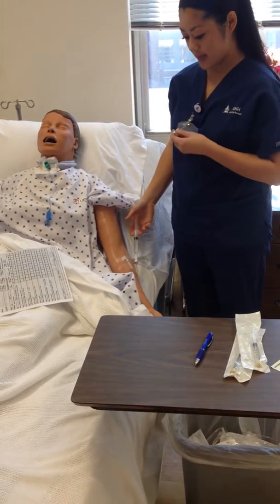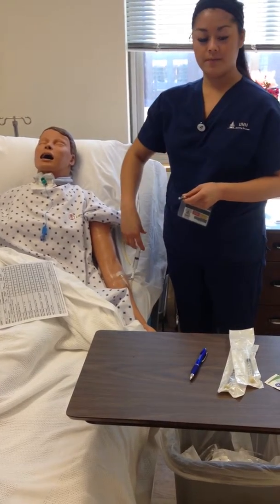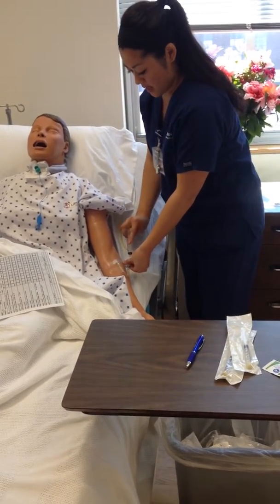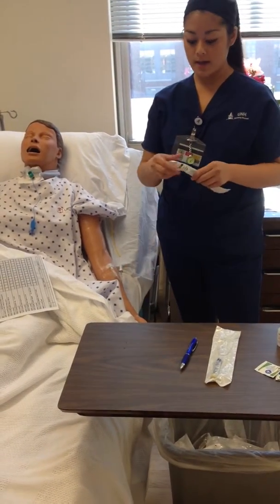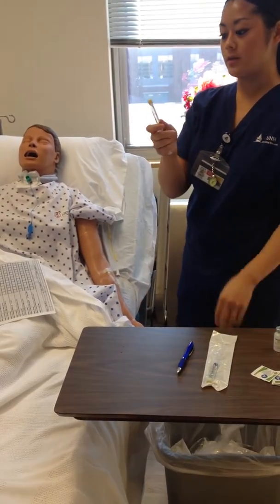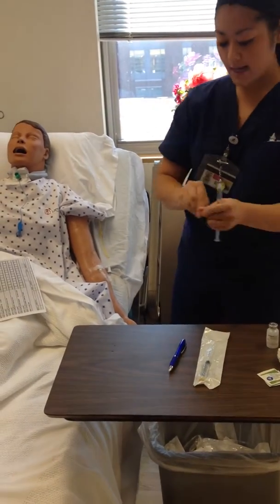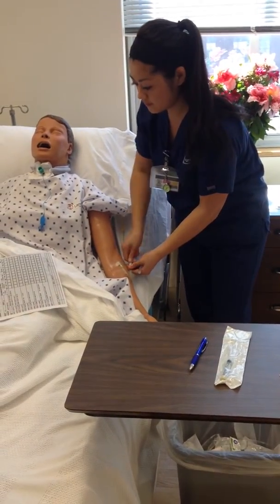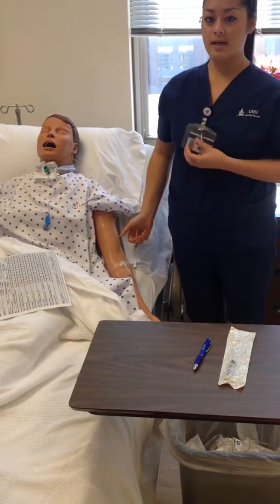So we take our watches and administer this over 2 to 3 minutes, pushing it slowly. So we're going to do a time lapse, and that was over 2 to 3 minutes. Next, we need to flush the line again because there's some medication in the line. And because that's the same medication, we need to do the same rate of administration. So this is going to go into the patient at 2 to 3 minutes. Scrub the hub again. And this goes in at 2 to 3 minutes.